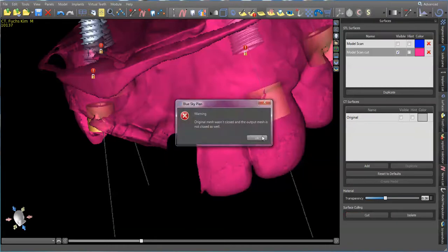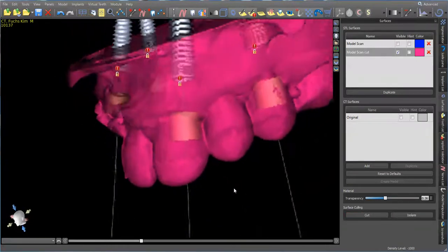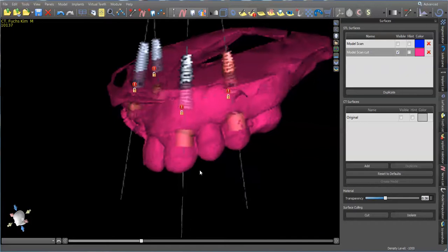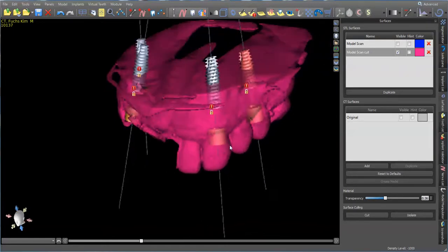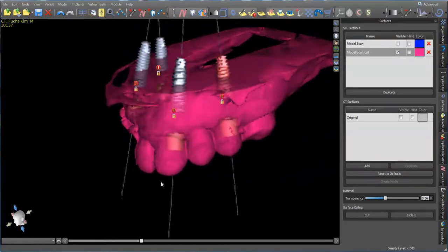Alright, so now all I have to do is remove this. If you'll recall, this is a 4-unit bridge, and all I need to do is remove this canine and these 2 teeth. So using my cut tool again.